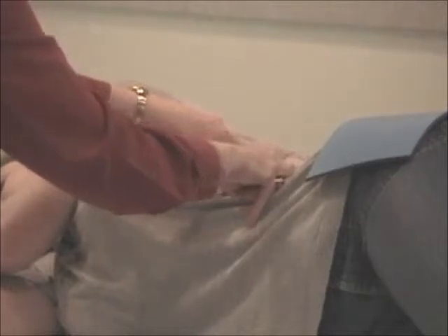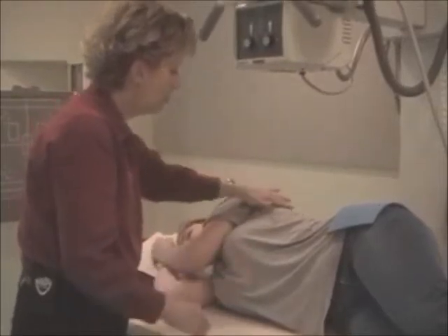Okay? Here's the crest. L3 is 2 inches above. And you can see that my halfway mark is approximately at the level of L1 or L2. Ballinger's will give you that option, that you should be centered at L1 or L2. We're giving you a more precise centering, giving you something to go for.